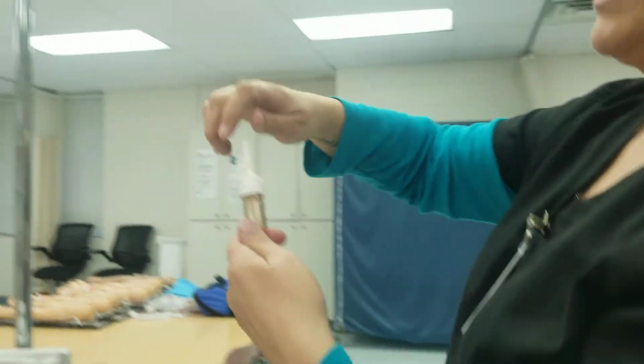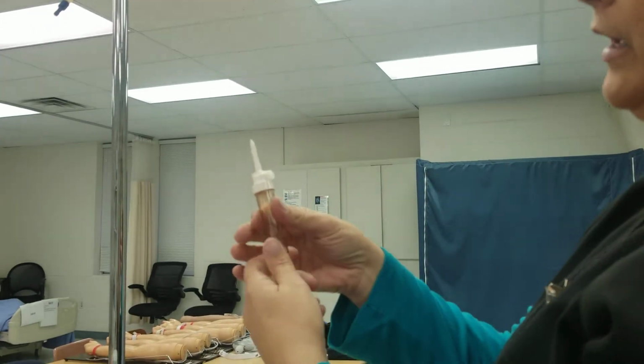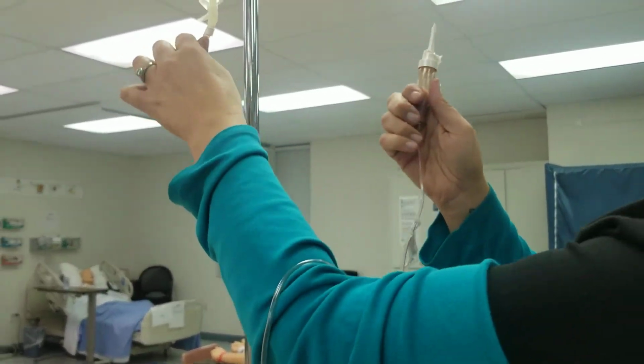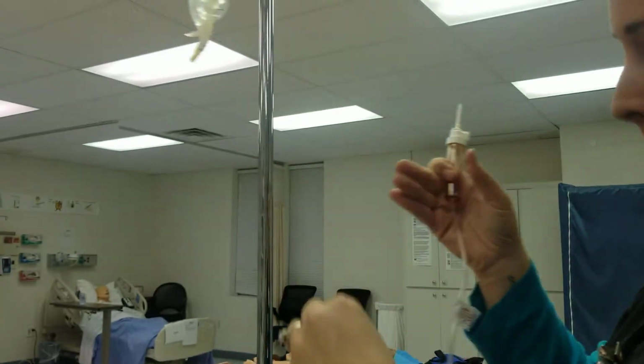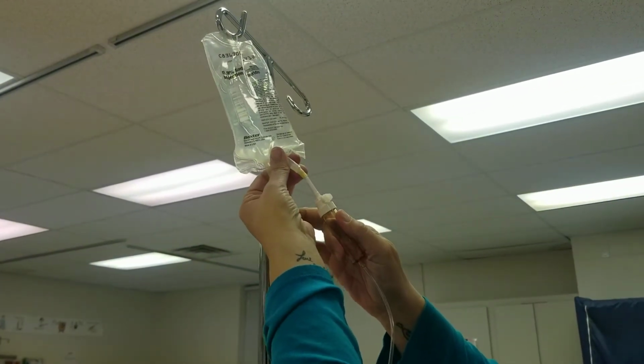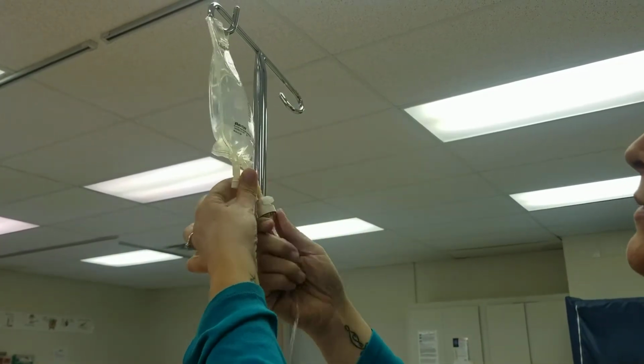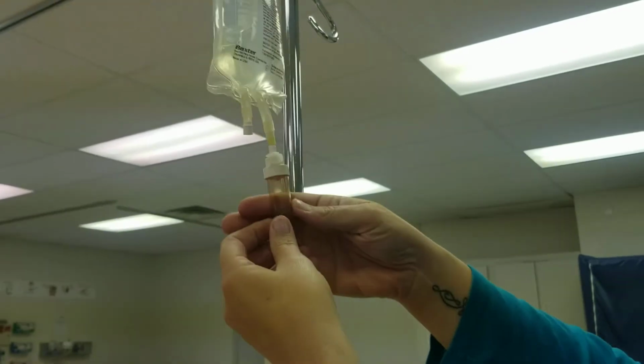All right, so I'm taking the cap off. I'm making sure that I do not contaminate the cap, okay? You'll pop this blue part off. You don't want to touch the end of it, but you want to access it in one quick movement. Get it all the way up in there. Make sure that it gets in there, okay?